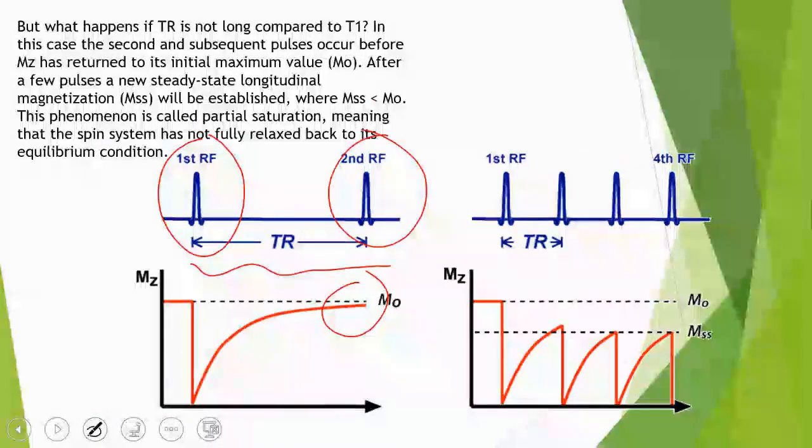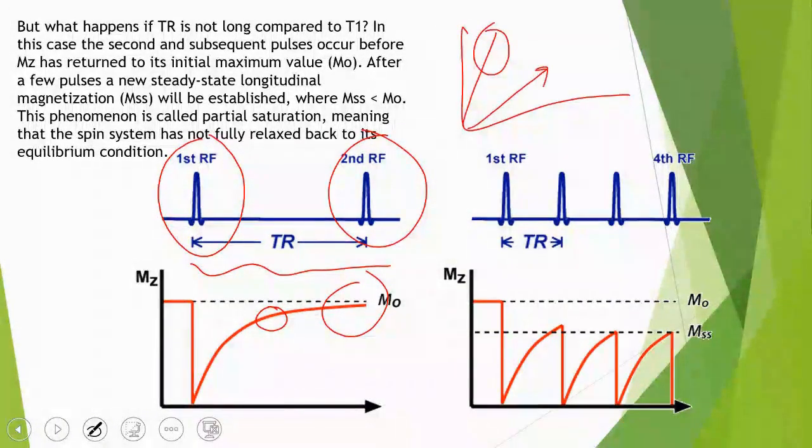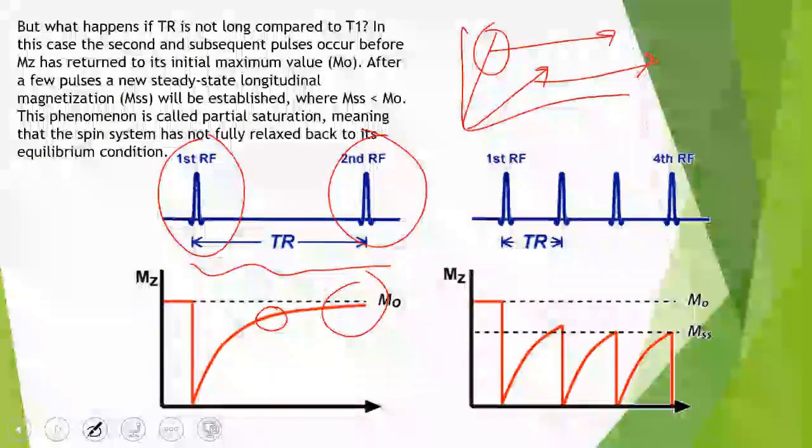Logically, based on what we were explaining, a high value of longitudinal magnetization should give you a stronger signal, right or wrong? This is what we were saying, the value of magnetization, and which one shows prominently, because it is higher in magnetization, inducing a higher current in the coil, resulting in a higher brightness signal.